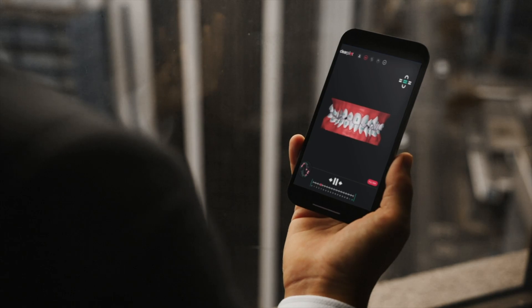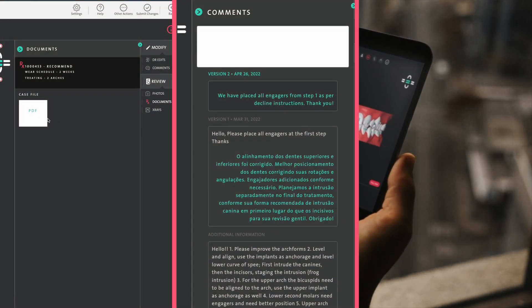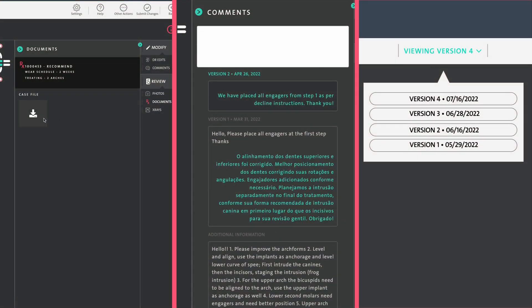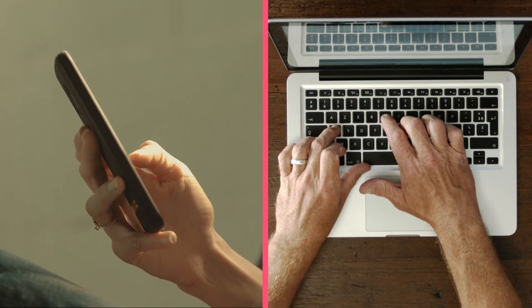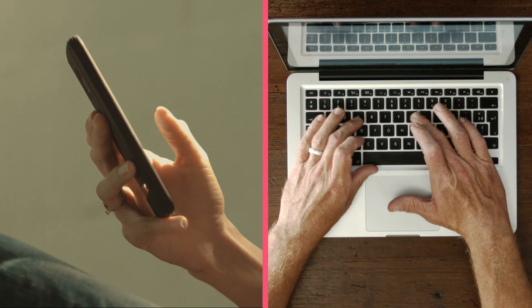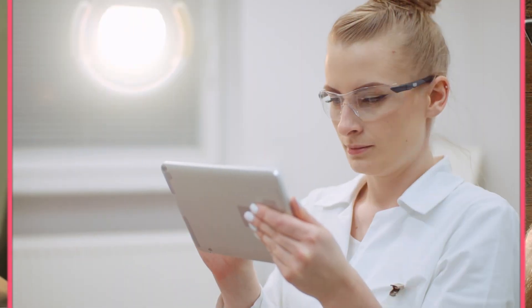With ClearPilot, case records, comment history, and previous setup versions are all just a click away. You can even share your setups with your patient remotely to help drive conversion and engagement, or get your extended ortho team involved as you share your case with other clinicians or staff.